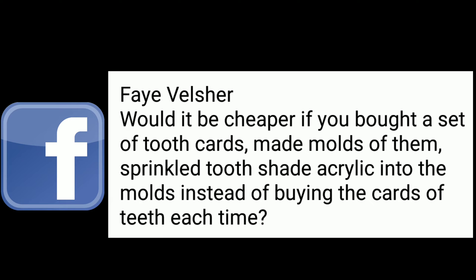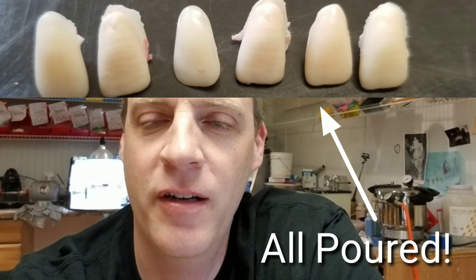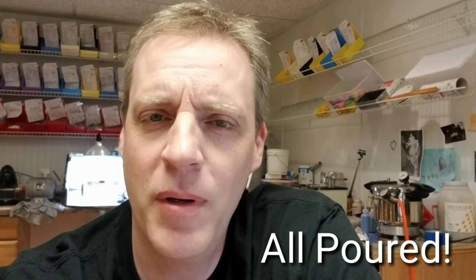Question of the day: would it be cheaper if you bought a set of tooth cards, made molds of them, and sprinkled tooth shade acrylic into the molds instead of buying cards of teeth each time? Hey Faye Velsher, congratulations on becoming a CDT. To answer your question, in this video I am not only going to create an acrylic tooth from nothing, I am also going to put it into an invisible retainer — all in about five to ten minutes.